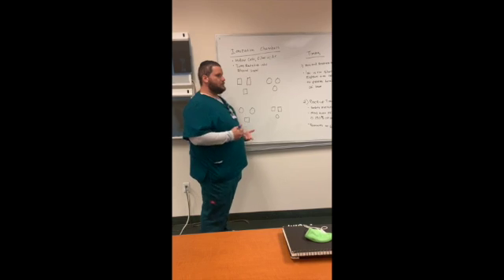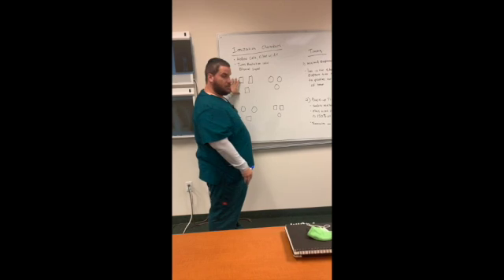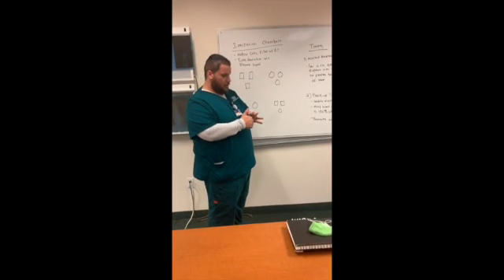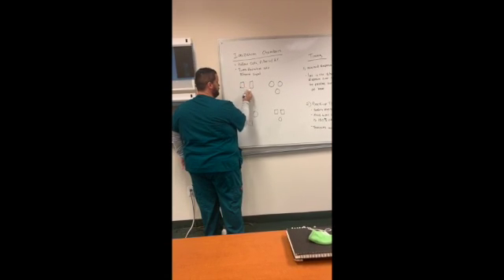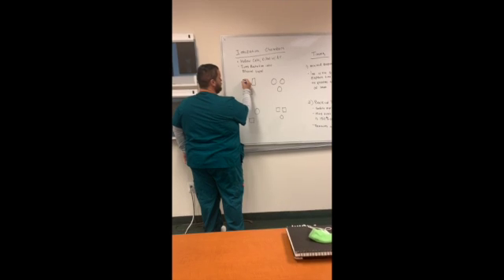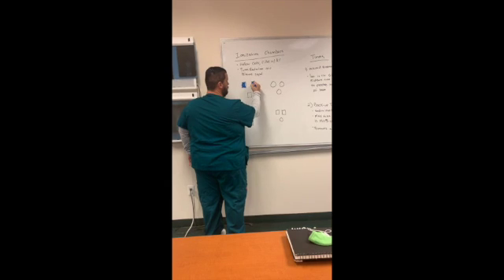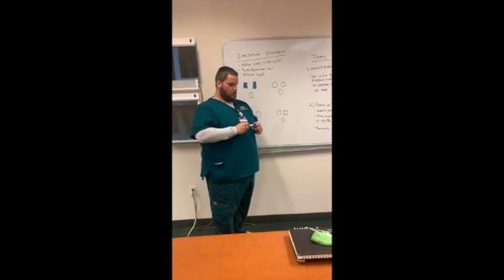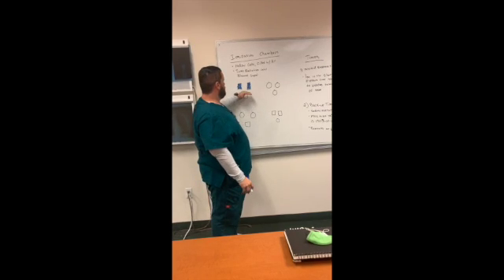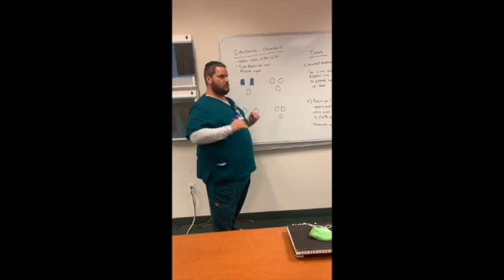Now, what happens is when the X-ray photons pass through the patient and hit the AEC chambers, they get ionized. For instance, if I select these two, once these two become completely ionized, the exposure stops. That means the exposure has reached its optimal level, and it terminates.